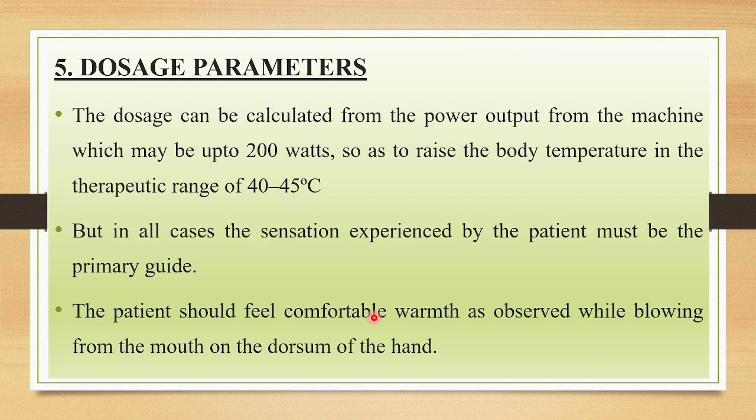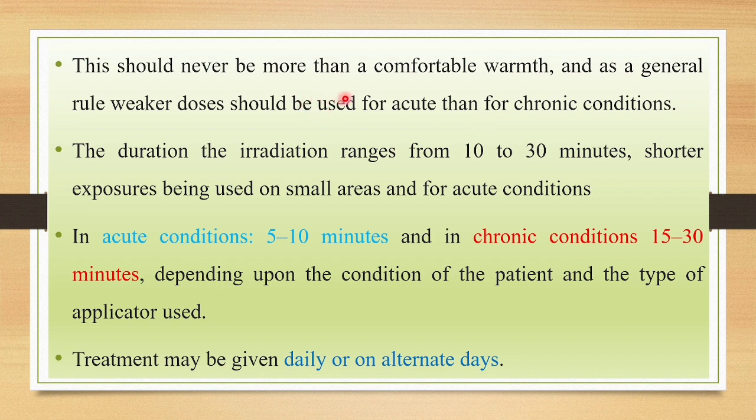The patient should feel comfortable warmth, as observed while blowing from the mouth on the dorsum of the hand. This should never be more than a comfortable warmth, and as a general rule, weaker doses should be used for acute than for chronic conditions.